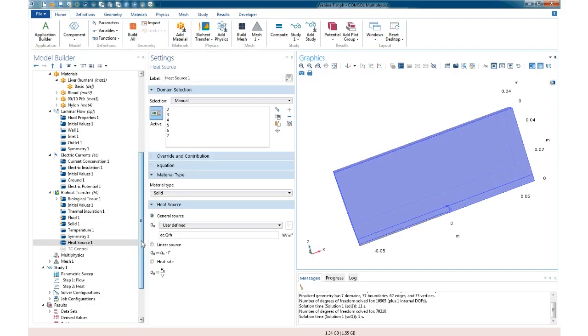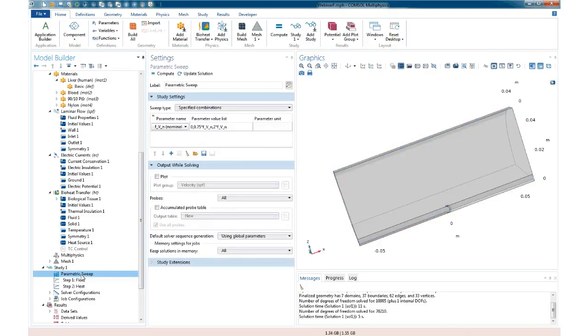So in this particular case, I'm going to do a parametric sweep. So remember I talked about the usefulness of using parameters. I've set the blood flow to be F sub V, and what I'm going to do is I'm going to simulate different strengths of blood flow from 0 up through something just below nominal to something just above nominal, and see what happens when I apply heat, see what kind of thermal lesion I get. So here we'll just push the equal button. And while this is baking, let's talk about what we've done.